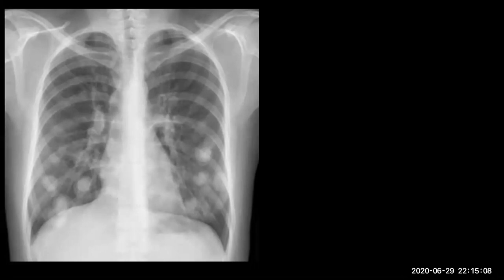Anyone for this case? Okay, sir, can I talk? You can, start. This is a chest x-ray frontal view of a mature skeleton showing evidence of multiple bilateral well-defined pulmonary nodules, mainly distributed at both lower zones. There is a normal cardiac silhouette. No obliteration of costophrenic angle. Normal skeleton and soft tissue. Very good. What is your differential?